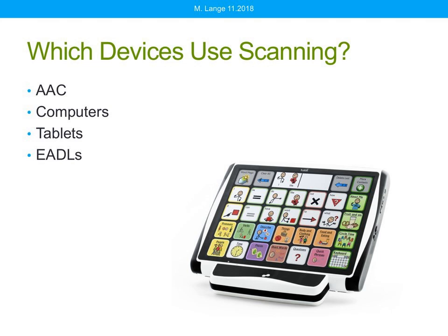There may be a scanning onboard, on-screen keyboard, other scanning strategies to move the mouse to different areas, like cross scanner. There can be scanning available on tablets, on certain applications, particularly a lot of communication apps, and some electronic aids to daily living that are on the market that can be controlled by switch do offer scanning.